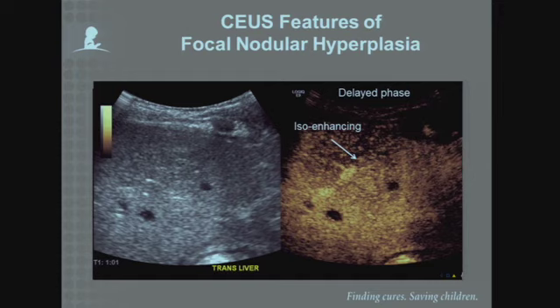This allows us to confidently diagnose what these liver lesions are and avoids needing to follow these patients with repeated CT and MRs to try to confirm that these lesions are not metastatic deposits.